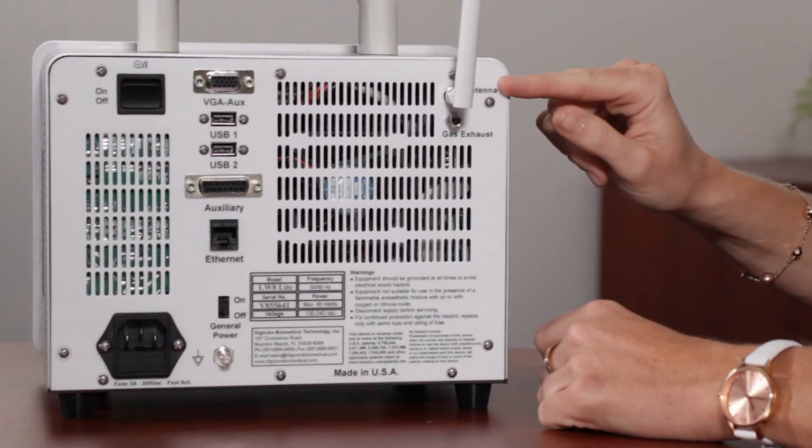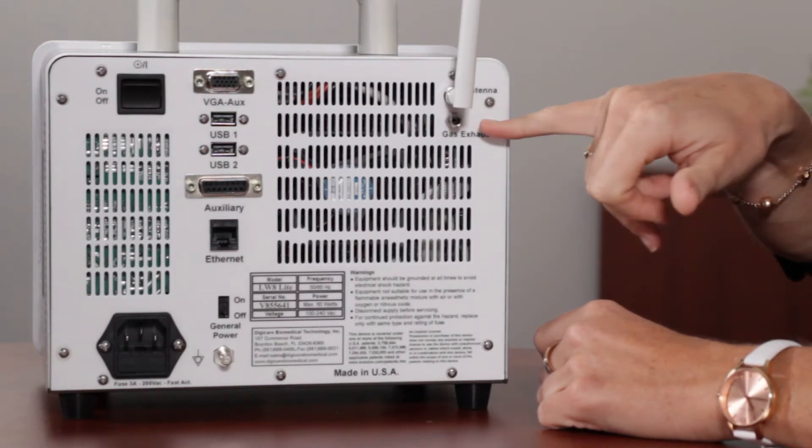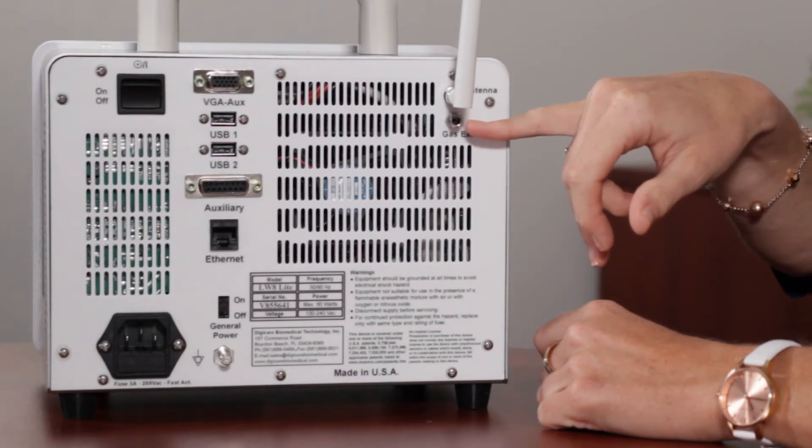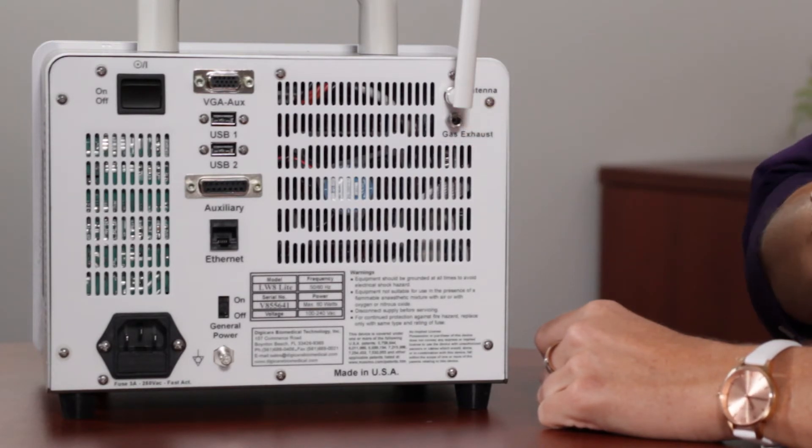Over here is where an antenna would go if your monitor does have wireless installed. This is your gas exhaust. Your gas exhaust is for if you have internal side stream CO2 and you need to exhaust the gas. The monitor does come with a sample line that you connect to here, and then you connect that to your scavenging system.